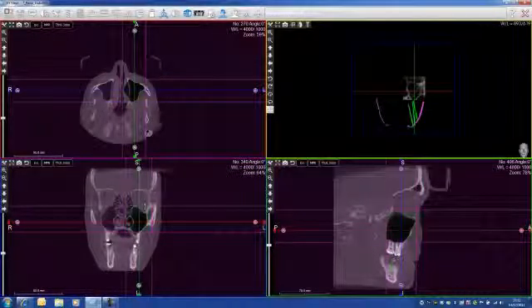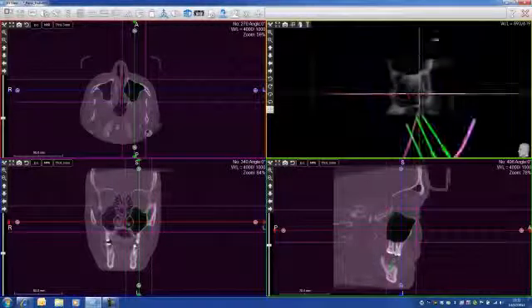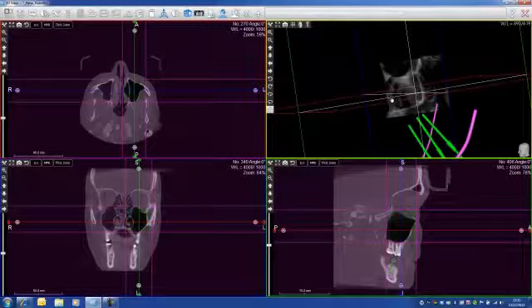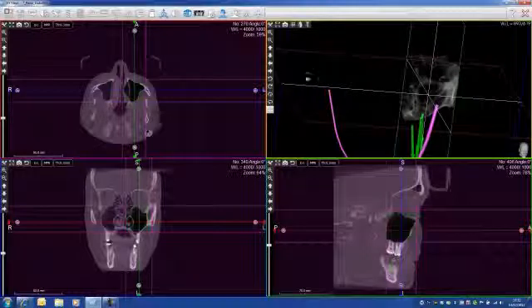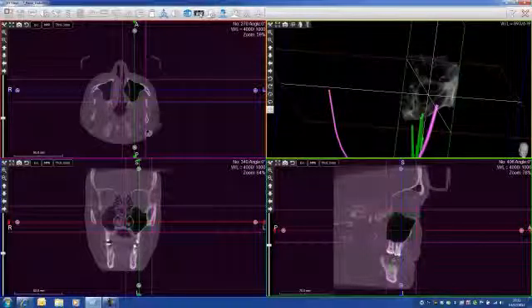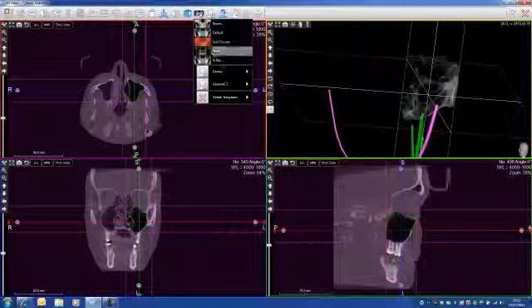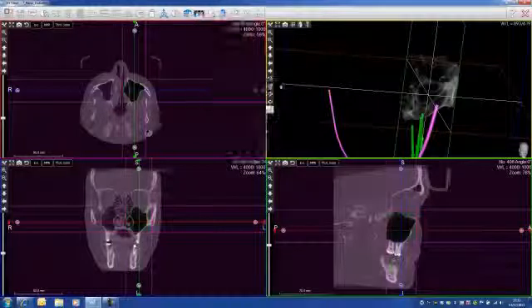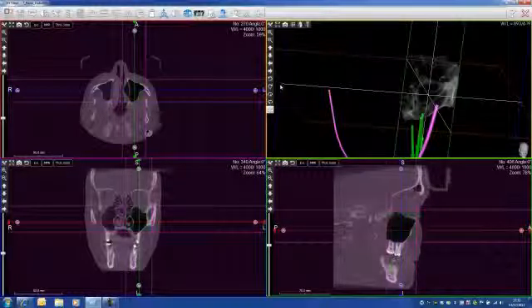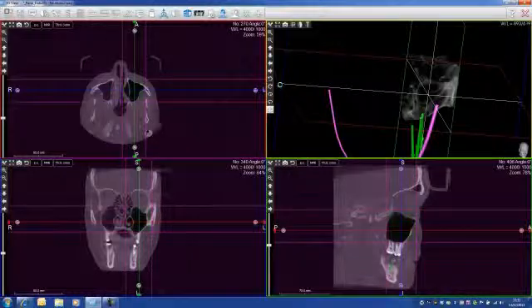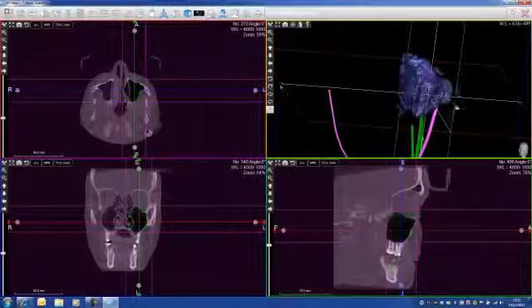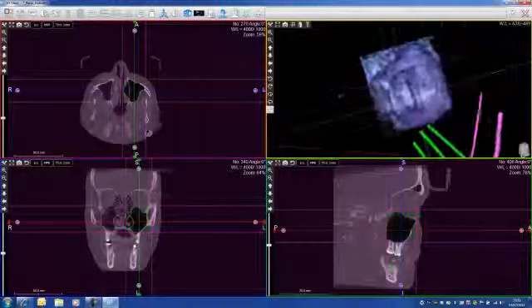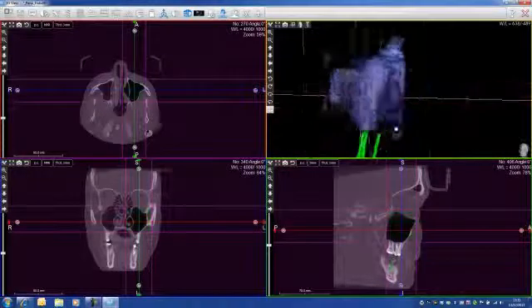Now I've got my sinus in 3D. But to see it a little bit clearer, I'm going to use a different filtering, which is the 3D filtering. I click here and go into General CT and Airwaves. It takes a bit of time to load. And as you can see, here is my sinus in 3D.